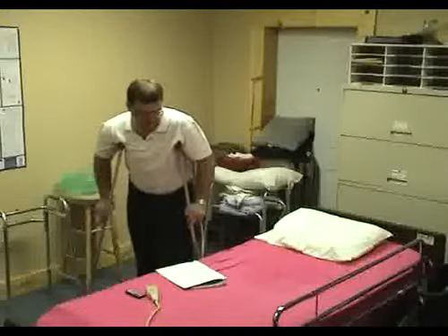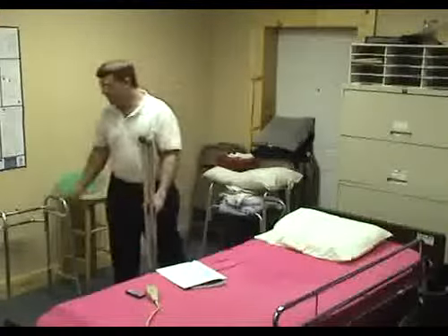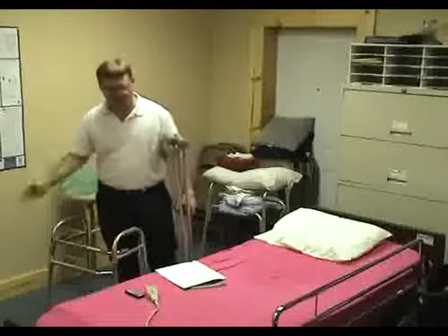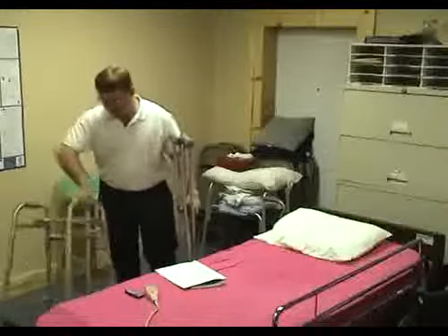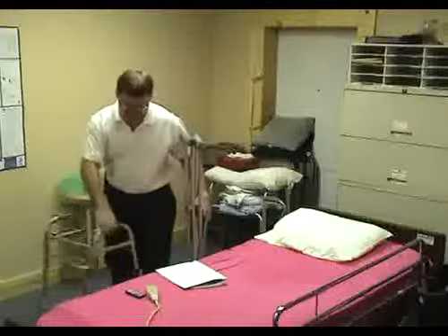B, position the walker with the open side toward the client. That way when they go to stand up, they don't have to turn the walker around and fall trying to turn it around. You don't want to place it this way. It's got to be this way.